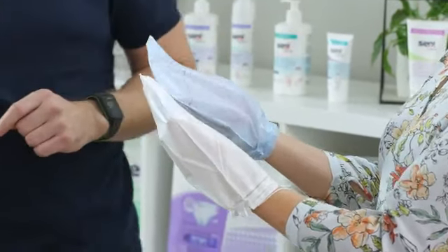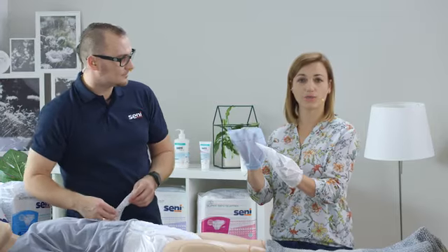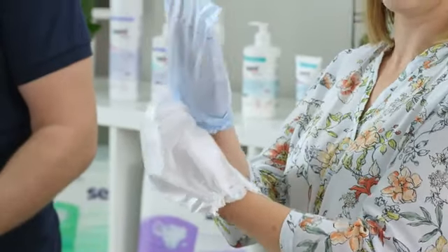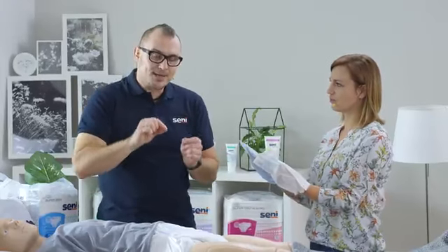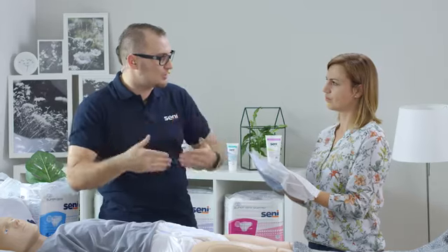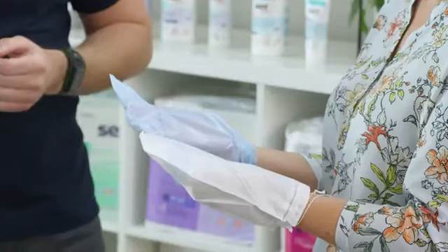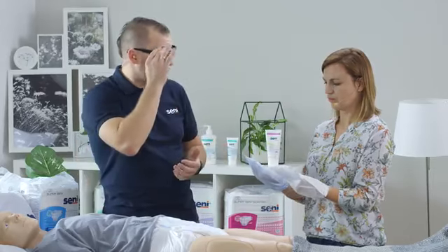You don't have gloves like these at home, but you can use, for example, a plastic bag. And also check how a person using non-breathable products feels. Yes, vapor permeability helps maintain proper body temperature. In fact, we sweat to maintain a body temperature of 36.6 centigrade. In case of a plastic glove like this one, it could actually result in body overheating and some chafes.